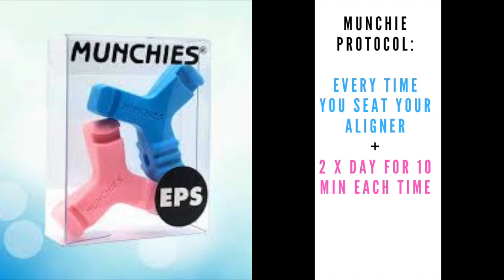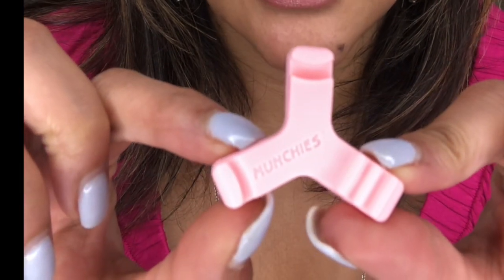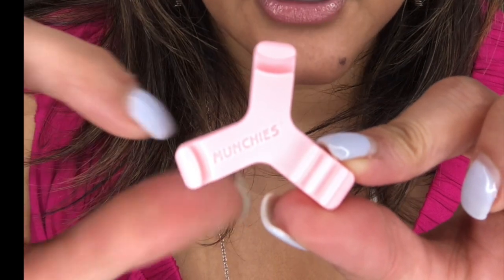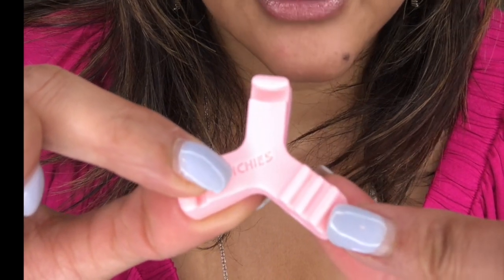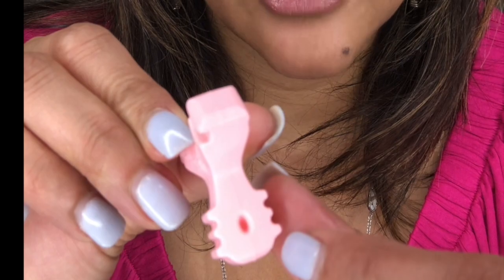To review the Munchie protocol, you're going to use your Munchie every single time you put your aligner back in your mouth for 10 to 15 seconds, and then twice a day for 10 minutes each time. The Munchie EPS is similar to the Munchie Classic — we've got a larger slot for your upper teeth, a slightly smaller spot for your lower teeth, and a ridged area for your premolar teeth. You flip it over and there's a little circle for your canines.